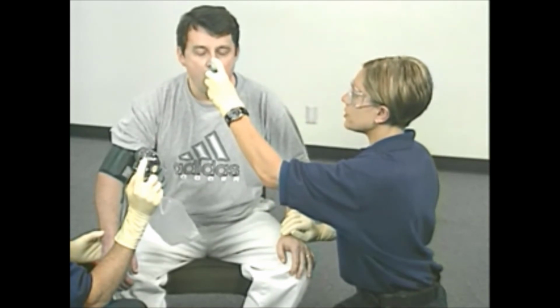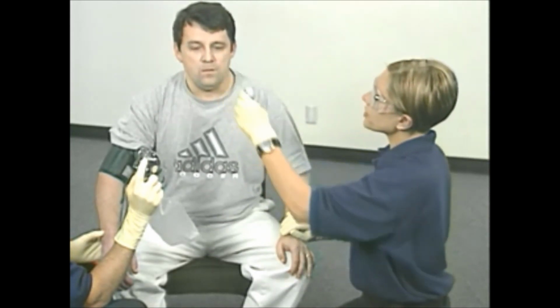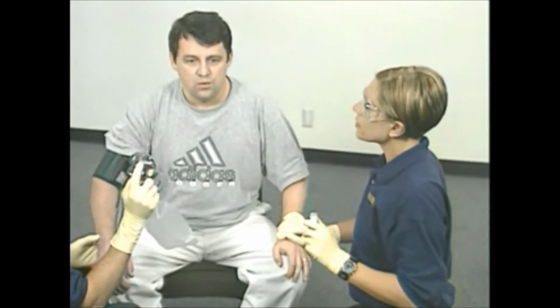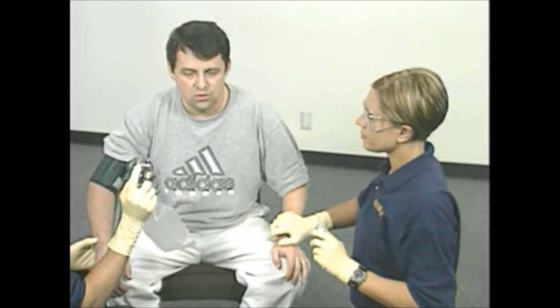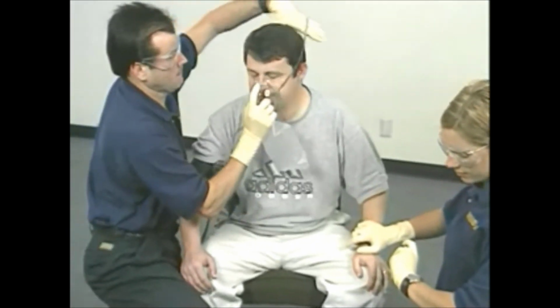Simultaneously, either you or the patient should depress the canister. Make sure the patient has started inhalation before the canister is depressed. Remove the inhaler and request that the patient hold his or her breath for 10 seconds or for as long as possible. Coach the patient to exhale slowly with pursed lips. Put oxygen on the patient if needed. Document the procedure.